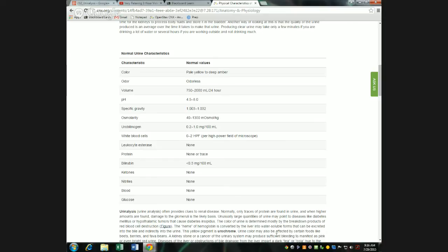So in this bottle here are strips of little colored squares. Each of these squares has been pre-treated with some chemistry which will react with the sample, and the color reaction coming from that will give you an indication of what's going on.